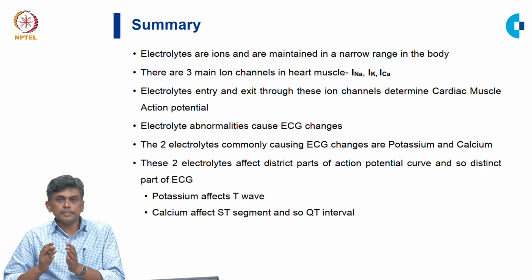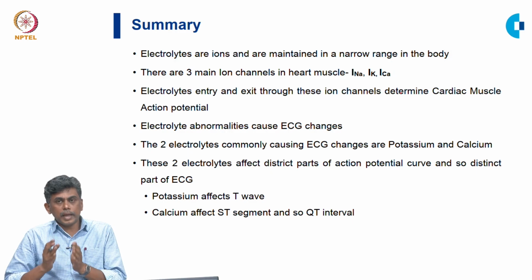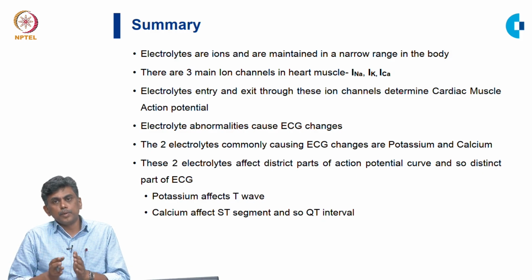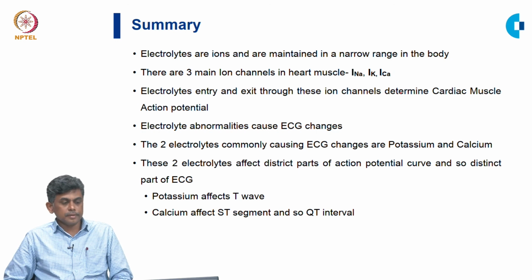With regards to calcium, it affects the ST segment. With low calcium, you are going to get a prolonged ST segment and QT interval prolongation. With high calcium, what you are going to get is shortening of the ST segment and QT interval shortening. Okay. Thanks a lot.